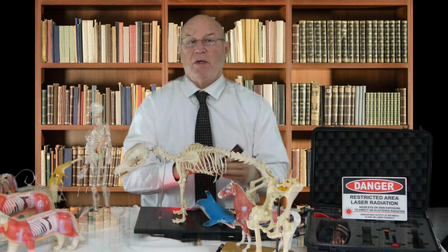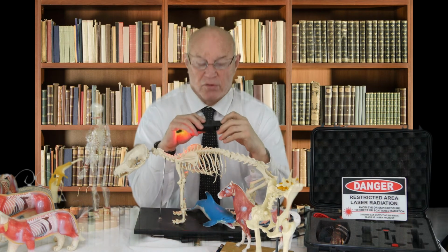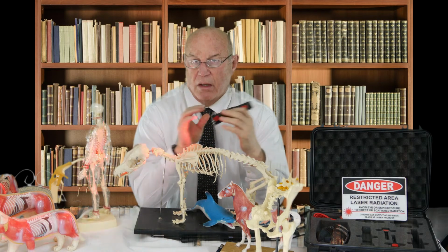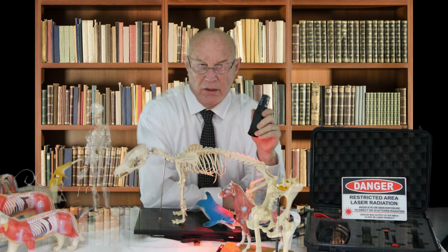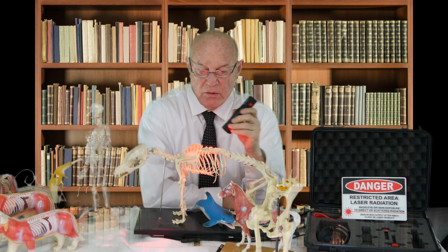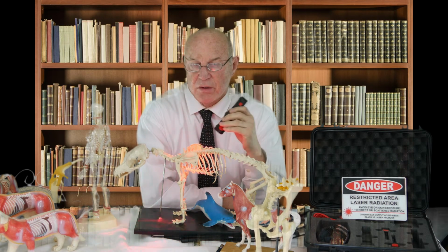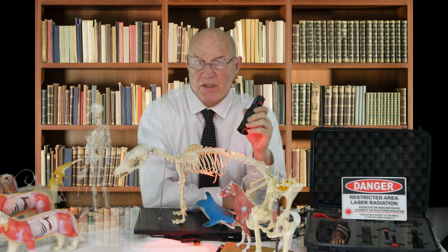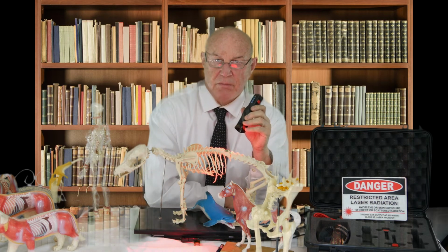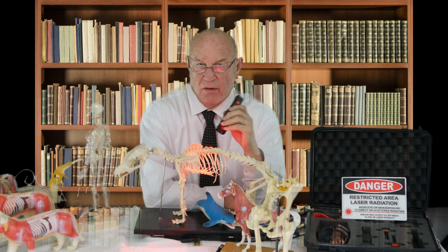Very, very seldom do we ever get an animal that quickly after an injury that has lost deep pain. So what we're able to do with this technology is theoretically treat these conditions. We don't know whether or not they're going to respond until we've had a chance to treat them for at least 3 weeks. During the first 3 weeks, or at least the 7 to 10 days, we'll see some sort of positive response.